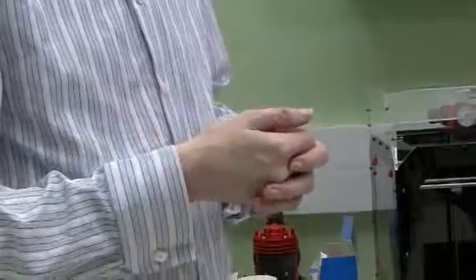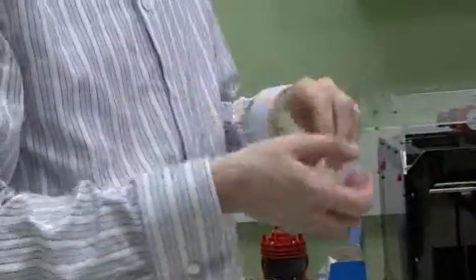The things that we're concentrating on at the moment is the refinement of the cells themselves. So you can't just sling a load of adult cells in and expect them to do the job. So what you have to do is you have to use new young cells. So this is where your embryonic stem cells come in. But we don't want to use embryonic stem cells forever because they've got their own ethical problems. They've got the fact that you're still using cells from someone else.